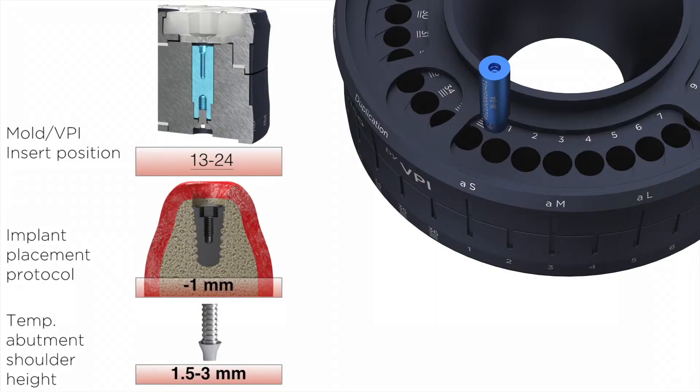Sockets number 15 to 28 can receive the VPI prosthetic connection insert, the last being one millimeter sunk into the sockets. This is particularly useful if your clinical protocol involves one millimeter sub-crestal implant placement.